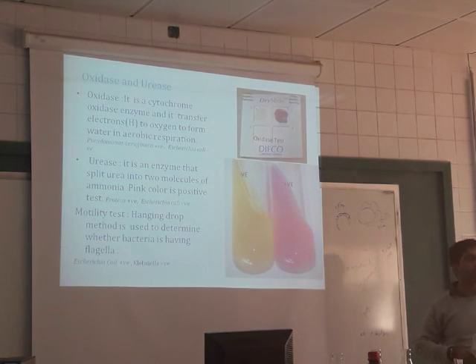Oxidase enzyme confirms that there is presence of cytochrome oxidase. You heard something about cytochrome oxidase? In biochemistry, you read that cytochrome oxidase plays an important role in the mitochondria for aerobic respiration. But in bacteria, there are no mitochondria. On the surface of the bacteria, the inner membrane of bacteria, there is presence of the cytochrome that plays a role.